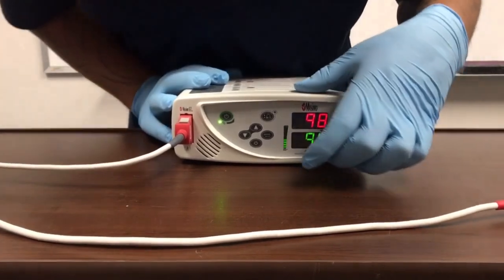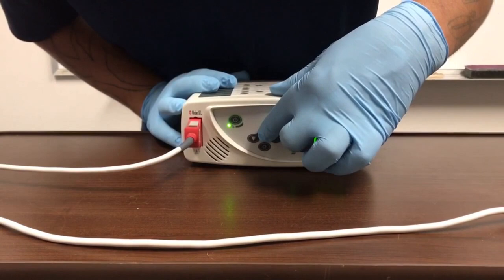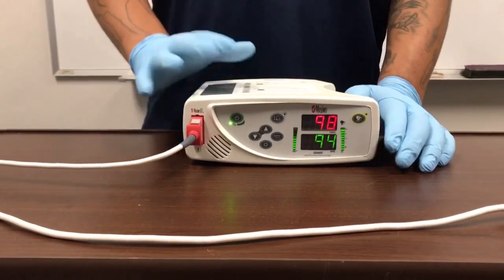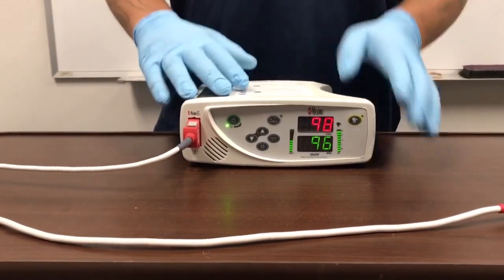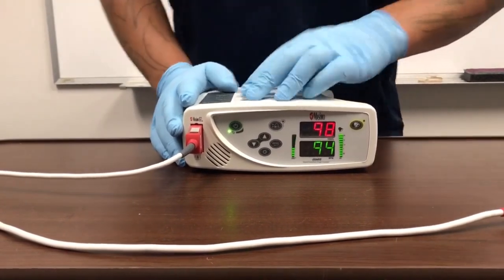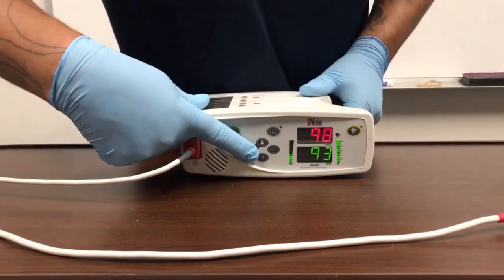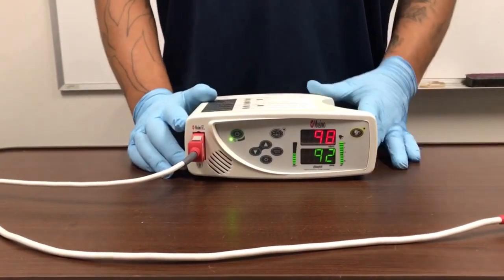The left here is the heartbeat, and you can actually adjust your sound so you can hear the child's heartbeat. So if you're in the other room, you can monitor with the sound. All you have to do to turn that off is just push down until it stops.